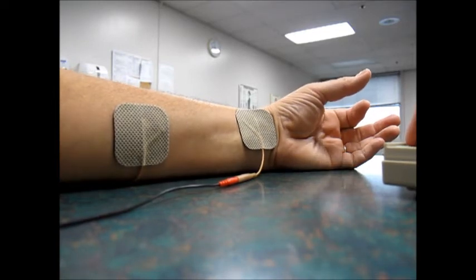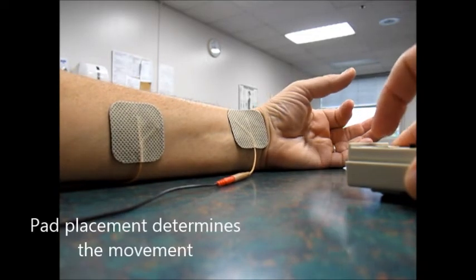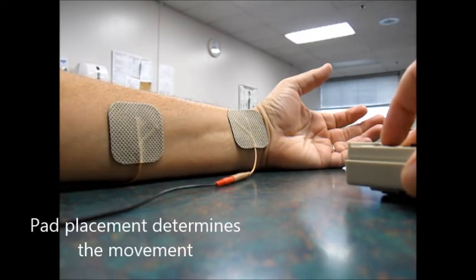See how the hand contracted, and then I turn off the intensity, and you can see it again. Fingers contract, and off.